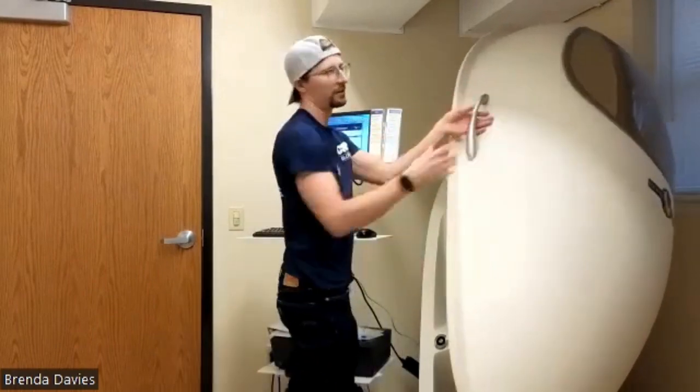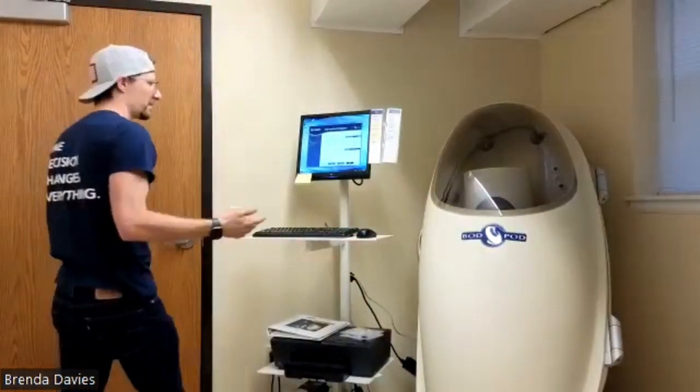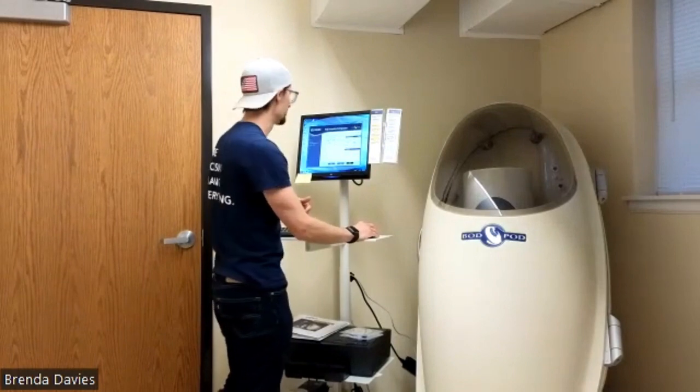All right, so now it says again, open up the Bod Pod door, place the 50.159 liter cylinder into the Bod Pod. Thank you very much. If you are running this, you want to make sure that the cylinder doesn't get damaged or dented. If it does, it's obviously not calibrated anymore because the volume inside of it has been compromised. So you do want to make sure that you don't mess with that. It's quite expensive to get a second.